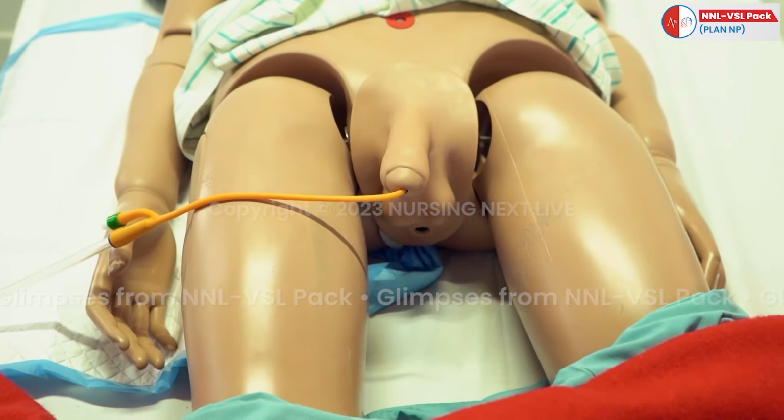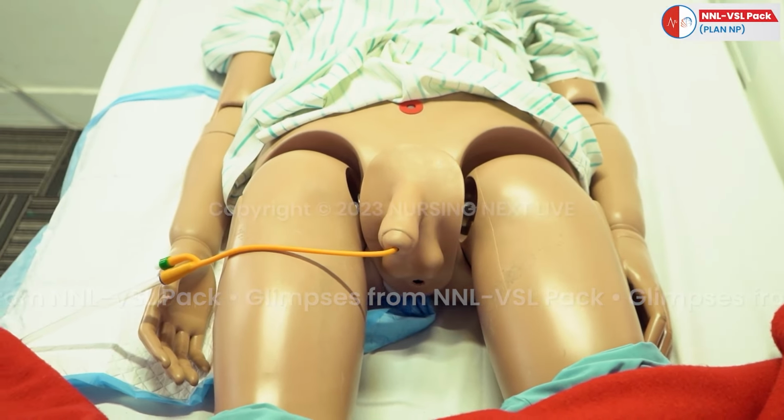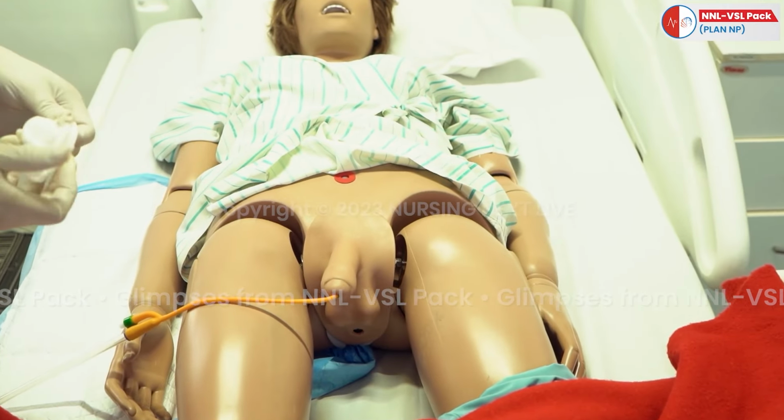With the help of another gauze piece, clean the catheter with single stroke in rotatory motion and in the same manner dry the catheter.